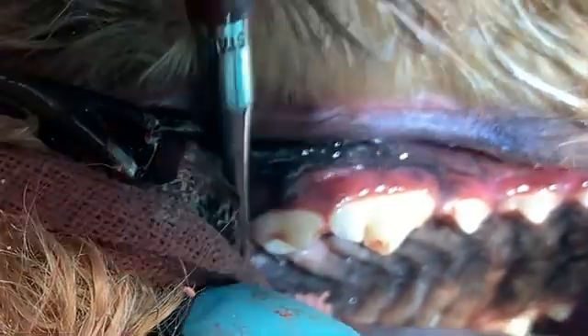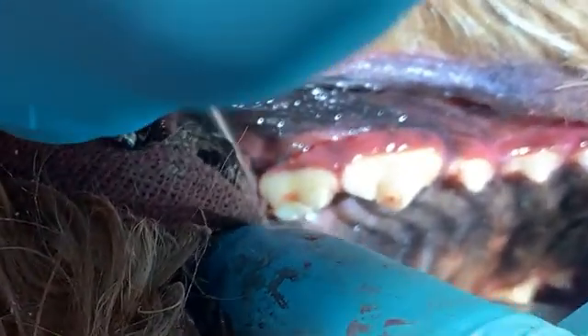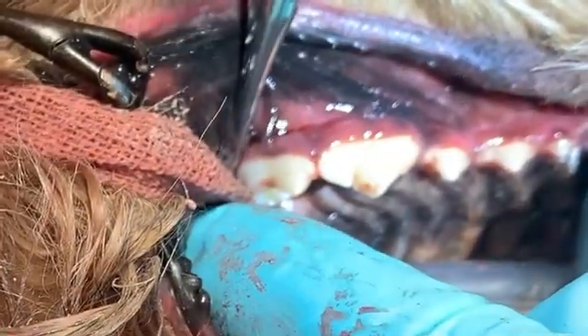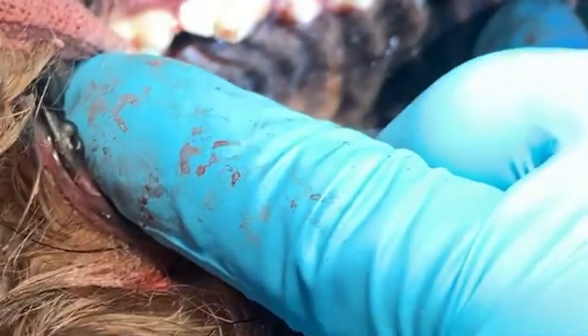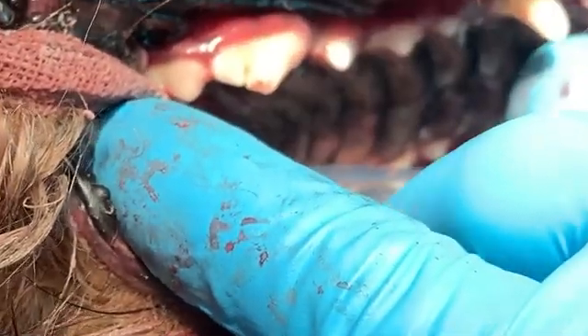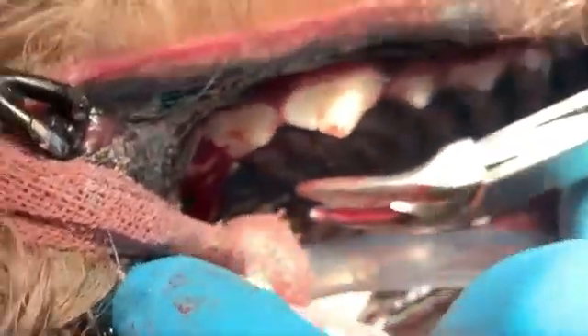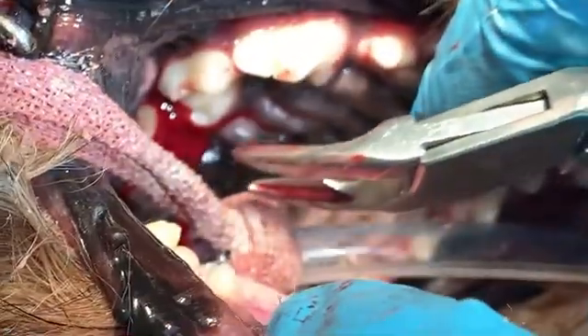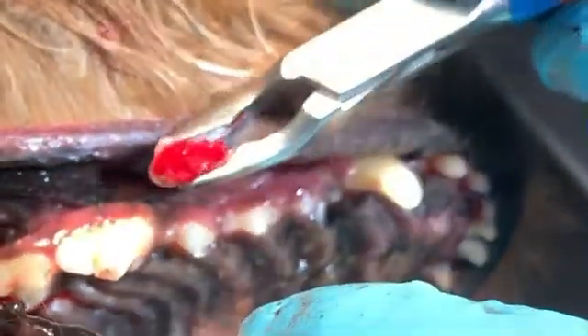You can feel it starting to go, so I'm going to back off for a second, reposition here, and go again. And it just rolls right out. The hardest part sometimes is getting it to release from the soft tissue that it's attached to — oftentimes you'll have to actually go in and cut that away. And that's that.